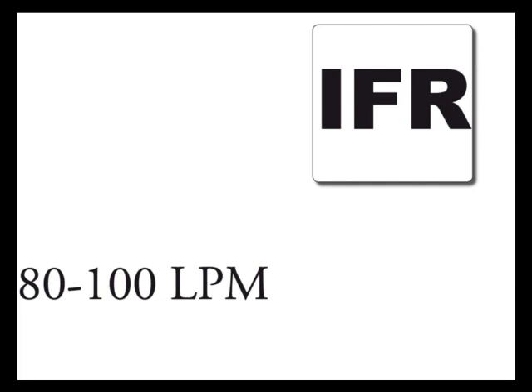So if you forget to adjust this dial, I always tell people if they have to forget about one dial, forget about the flow rate dial, and nothing bad will happen. If this got set to 60 on these asthmatics or COPDers, no real change. The amount of difference it makes is almost negligible. All right, the FiO2 and PEEP dial. These are easy as well.